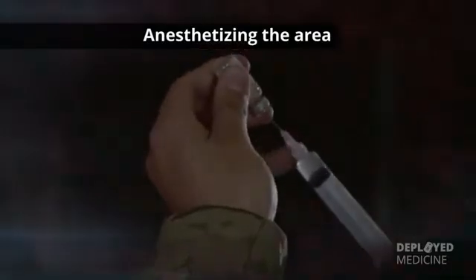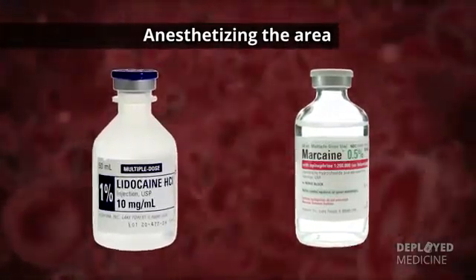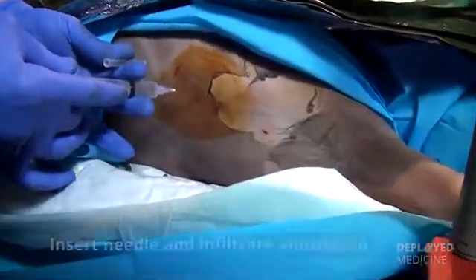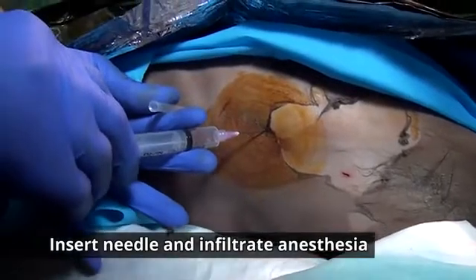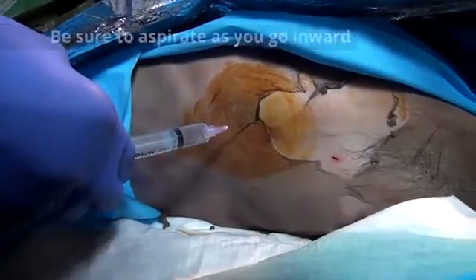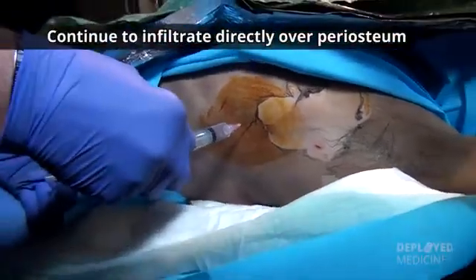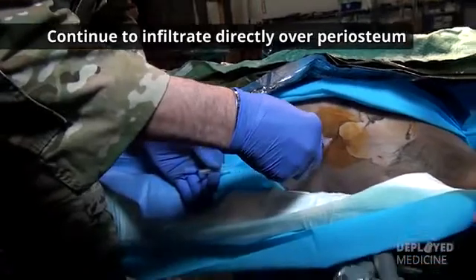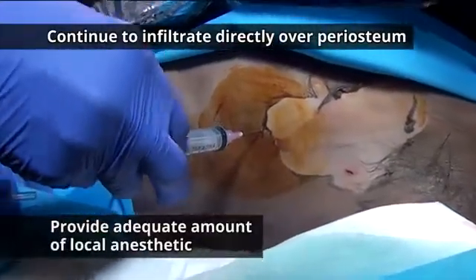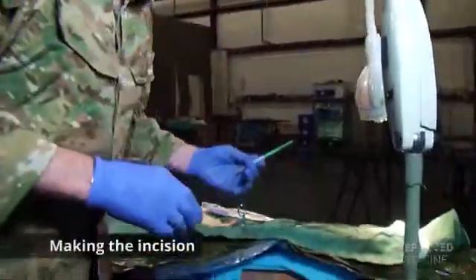An appropriate local anesthetic might be 1 or 2% lidocaine and possibly Marcaine also. Go ahead and insert the needle into the skin and start to infiltrate the anesthesia into the area. Make sure you aspirate as you go in. Continue to infiltrate the area and then get right over the periosteum there and make sure you provide an adequate amount of local anesthetic.